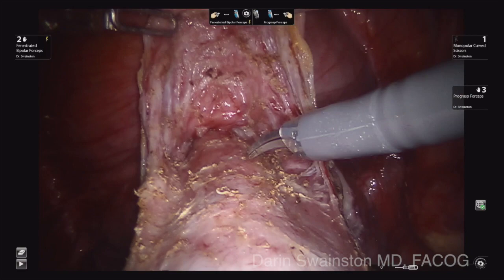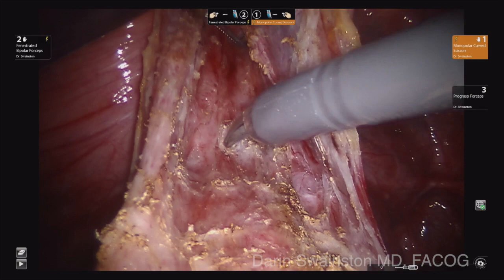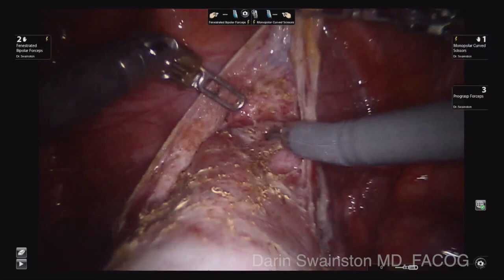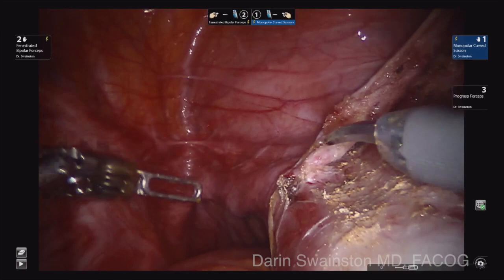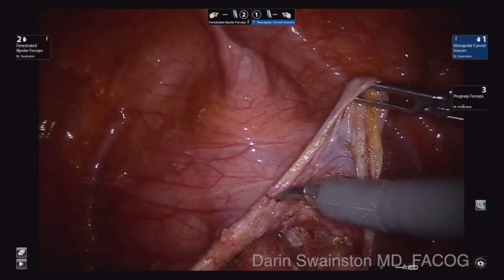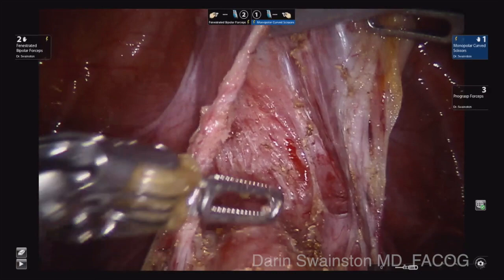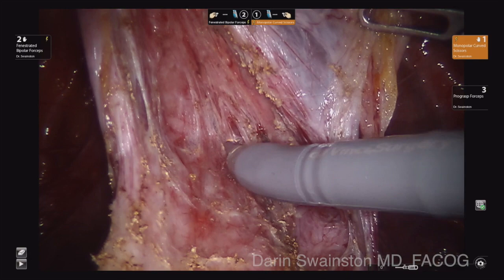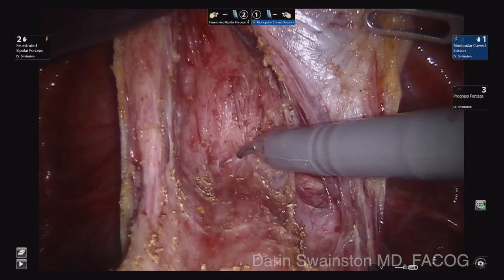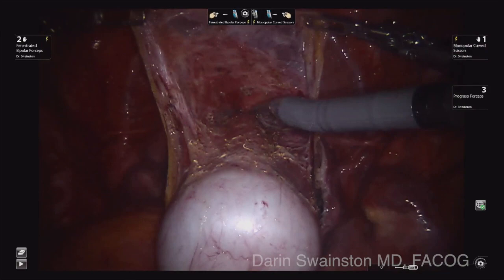I am just making sure they are draining that bladder and pushing the UPS system with the Cooper Surgical vaginal manipulator. If you are questionable about how low you are and where the ureters are — because the ureters can come in down here on the lower side — you can inadvertently damage those. Pull that up as wide as you can and then have somebody come in with their finger just underneath the base of the urethra and gently pull upward, or they can give a gentle pull on the Foley bulb. When you see that Foley bulb bouncing, you know exactly where the base of the bladder is.